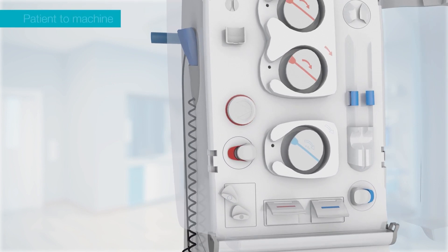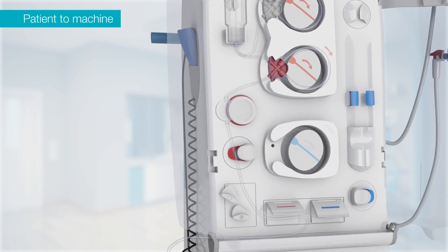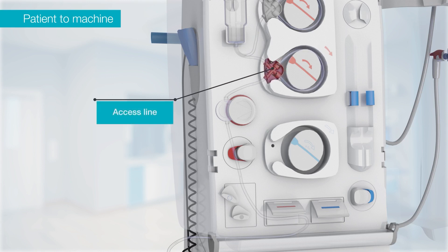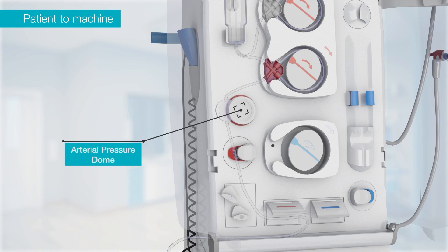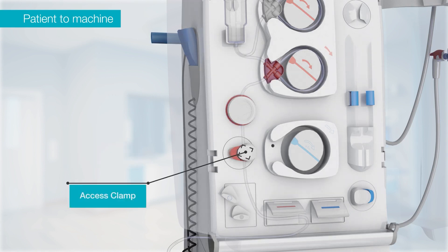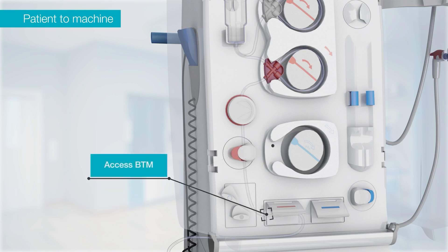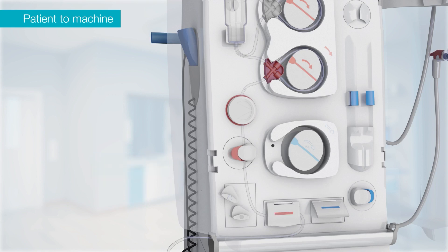For the connections of the patient to the machine, fit the arterial line, also called the access line spike, into the blood pump. You will hear the machine beep. Slide the line into the arterial pressure port. Next, put the line in the access clamp. Attach the arterial line into the blood volume monitor, followed by the access blood temperature monitor. Connect the heparin port if needed.